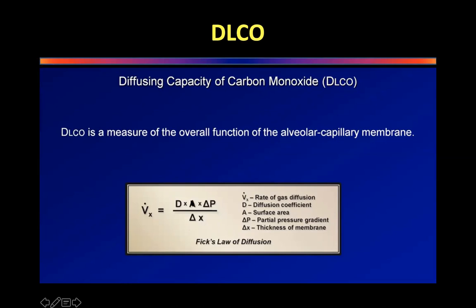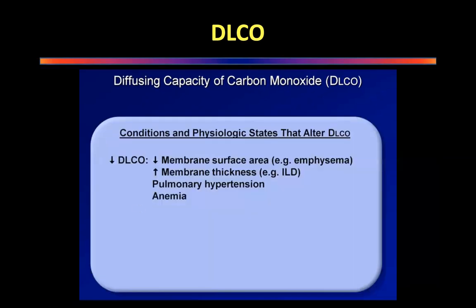So really, you can calculate the surface area of the thing, and you can calculate the amount of carbon monoxide by using this formula. It very clearly gives you. So some of the factors are very well established. You only have one unknown factor on this side, one unknown factor on this side. So V is equal to the number that you get.